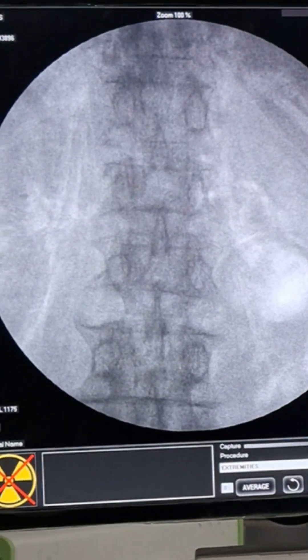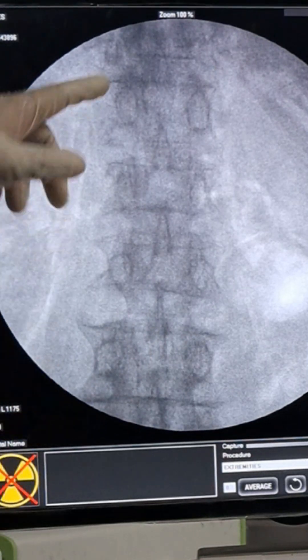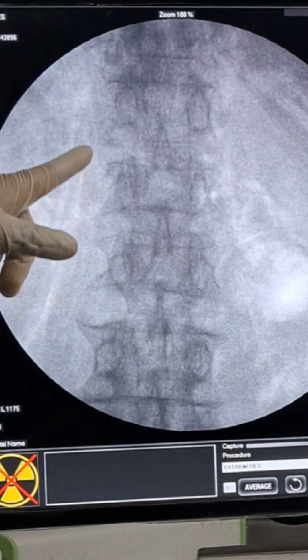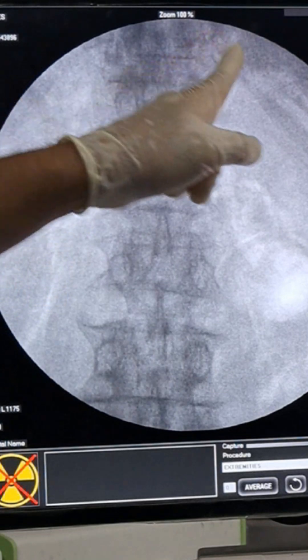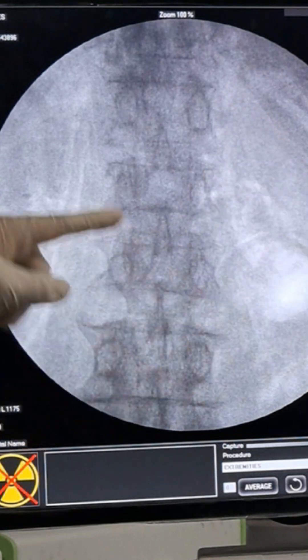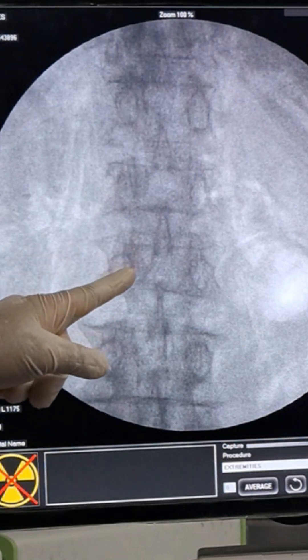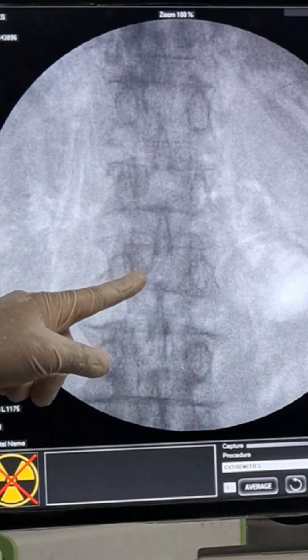Now I am going to show you the lumbar sympathetic on the live image. You can see here: this is T11, here is T12, this is L1, this is L2, this is L3. So if targeting L2, this is my target at this level.